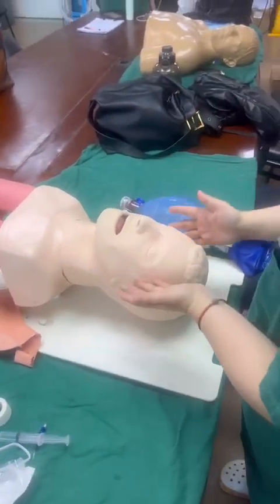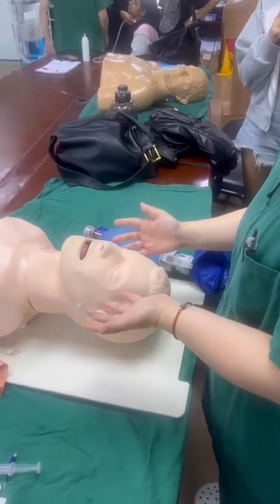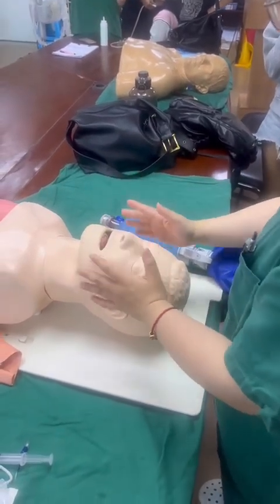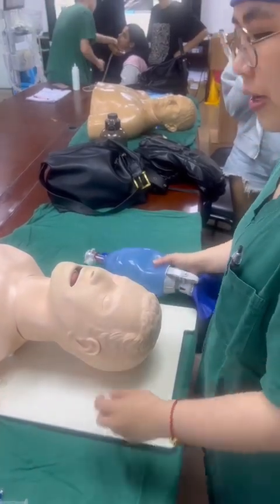Patient, what's your name? Where do you live? And what surgery will you do? Check the patient's information firstly, and then we check the things about the tracheal intubation.